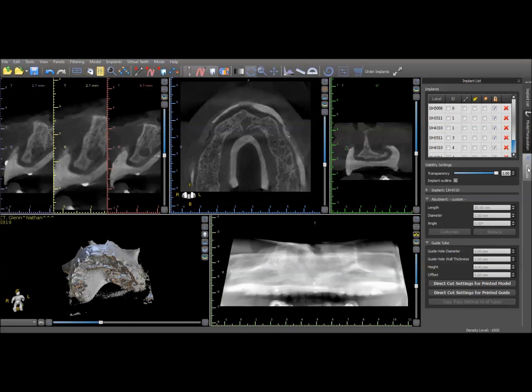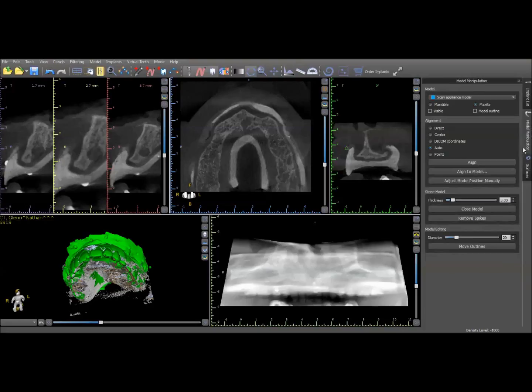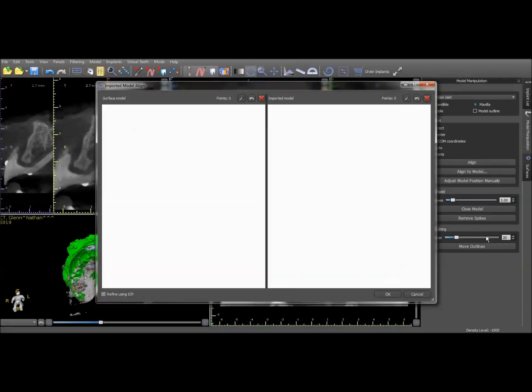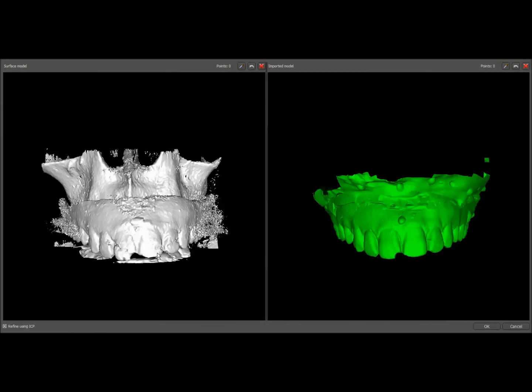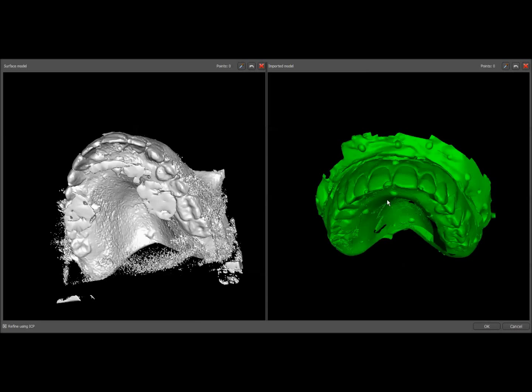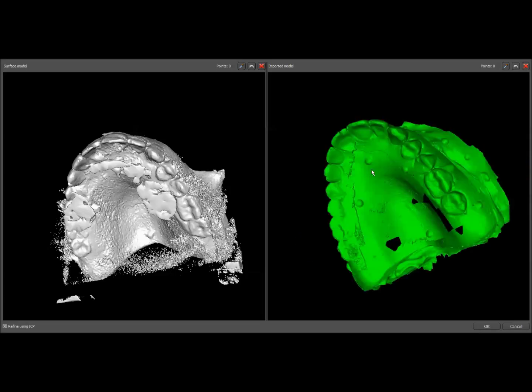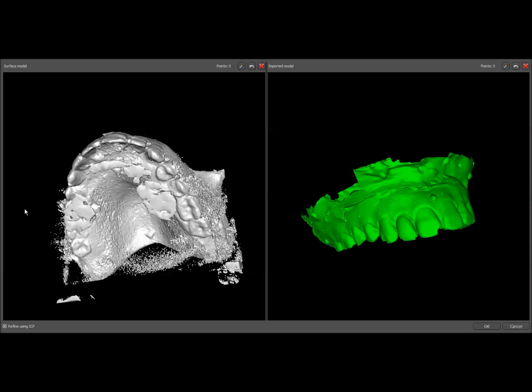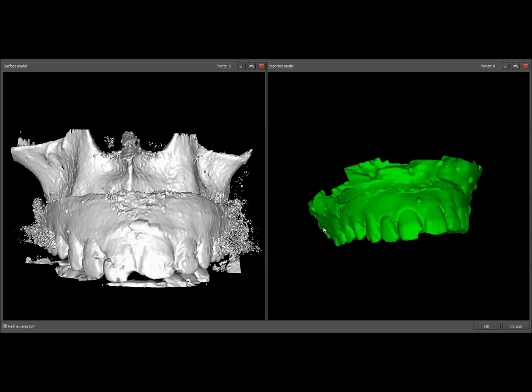I've already imported these STL surfaces, but you would just go through your standard procedure of importing an STL surface. I'm going to go ahead and do this data merge for the sake of demonstrating. Here's the window that comes up when we import our first STL surface. The one you want to import is the first one you created — the one that has the denture surface and all the land area. We're going to go through our standard merge process just like we would do on a dentate case.